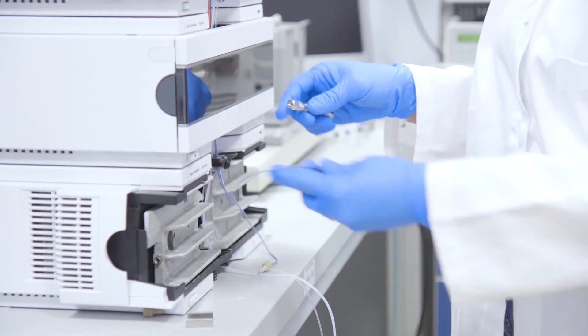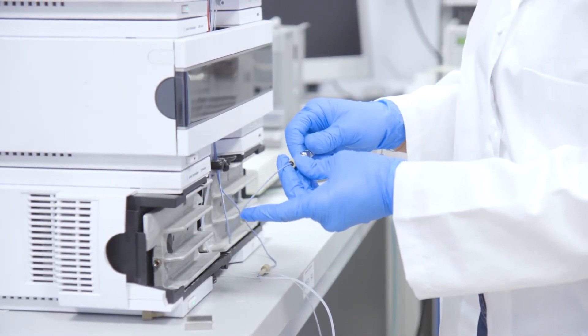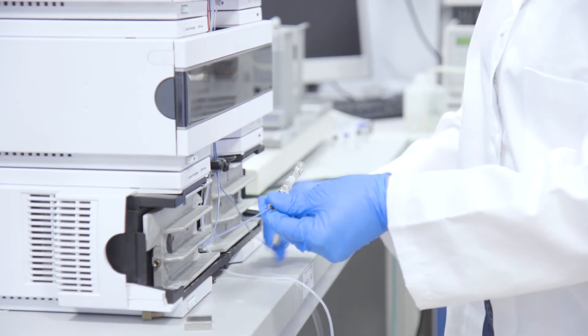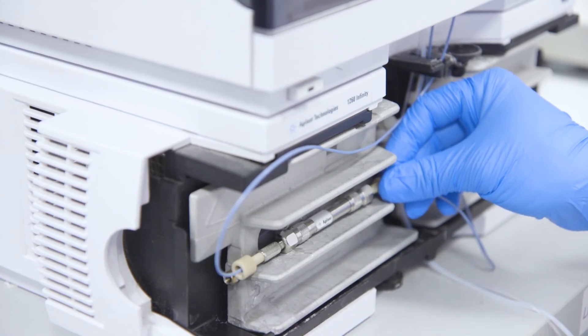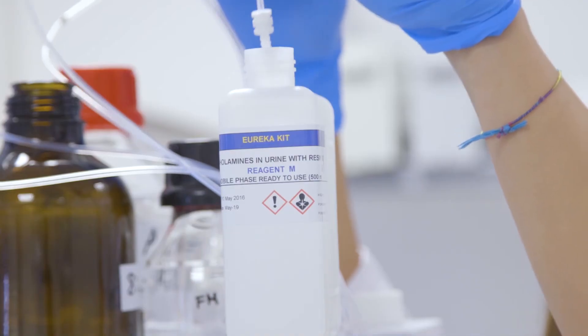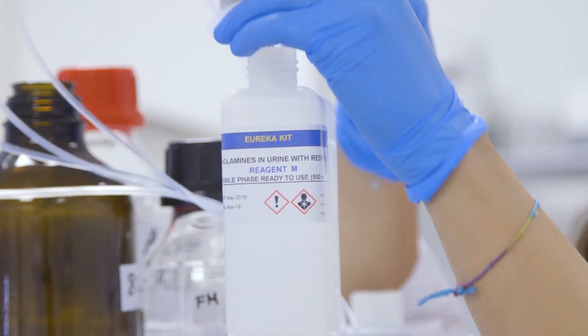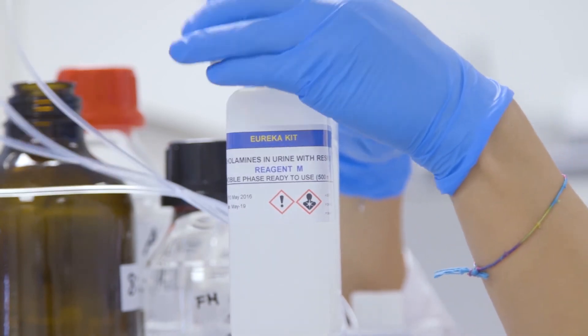First, we prepare the HPLC. The instrument must be cleaned from the previous analysis. We connect the clean analytical column to the system, insert the filter into the mobile phase reagent M, and let the pump flow at one milliliter per minute for one hour.